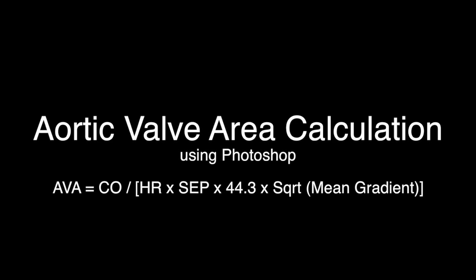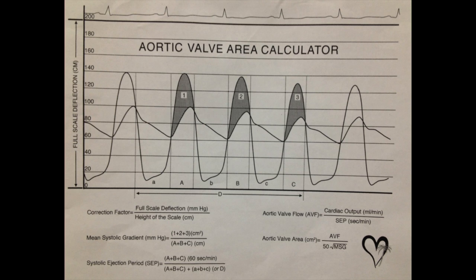This is a demonstration of what we do with the measurements of the LV and aortic pressures in the cath lab, in which we collect this data and then we use an old-fashioned method of planimetry of the area in between the aortic valve and the LV to calculate the mean gradient and eventually the aortic valve area.